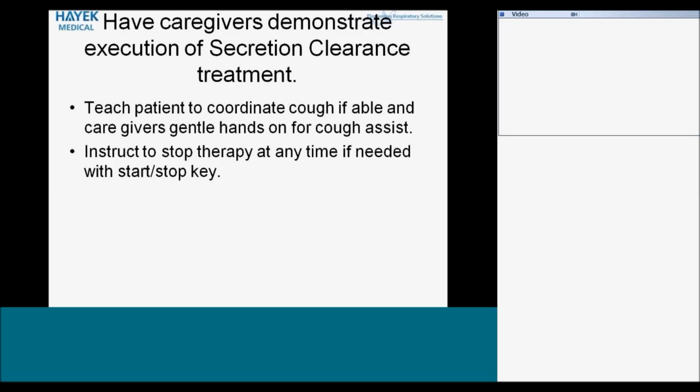So they may need to remain aware. If there's, for example, 5 cycles that are prescribed and the patient has done 3 and the treatment is stopped, then once they resume, they'll only need to continue through 2 of them if they want to complete the prescribed treatment. So that's something to be aware of.